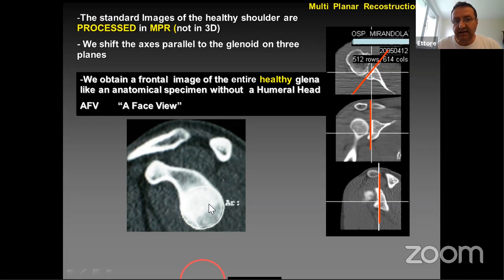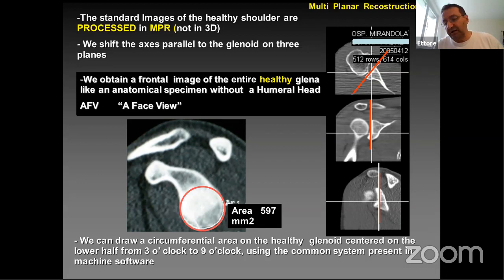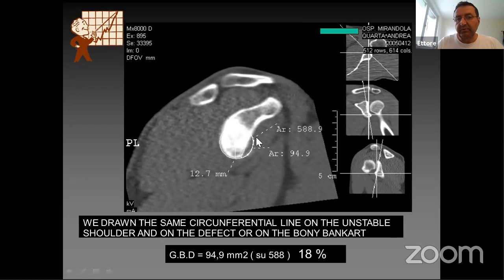And this is really not complicated and actually looks that is also very precise. And most of my patients with multiple dislocation have this kind of image, which is not the inverted pear. We can observe an inverted pear sometimes, but I think maybe Burkhart and Beer were seeing many inverted pears because they have to face mainly a special population of unstable shoulder rugby players or American football players. In Europe, these patients are not so common, but we have patients with multiple dislocation.